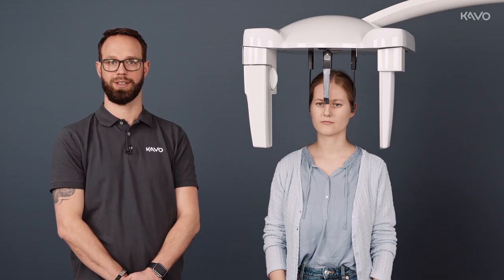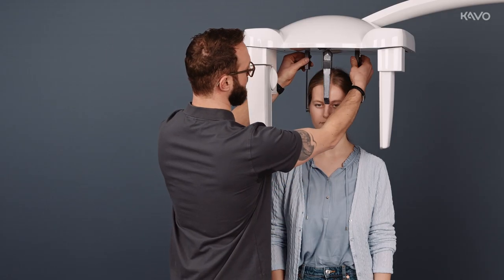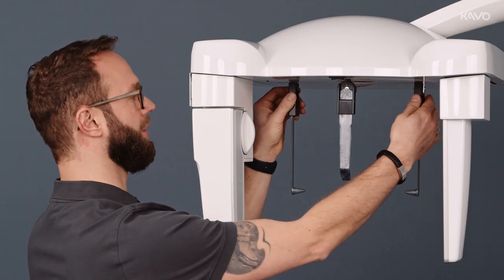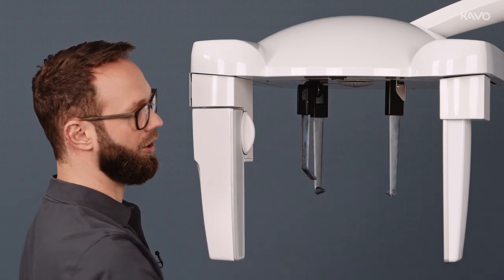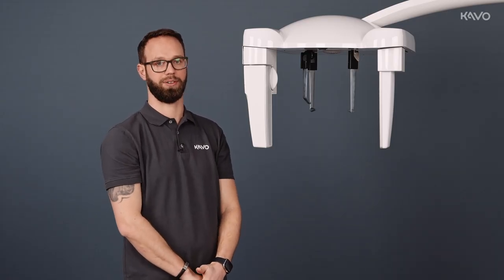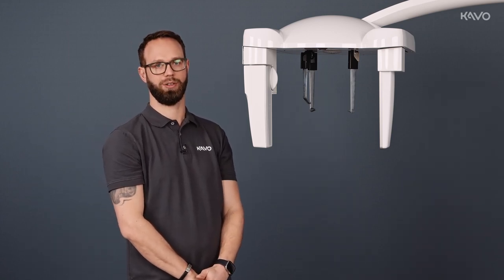We leave the X-ray room, ask the patient to stay still, and trigger the imaging. The entire frame can be rotated for further anteroposterior and postero-anterior positioning. Oblique imaging is also possible. The positioning remains the same. You can find other types of positioning in our instructions for use.